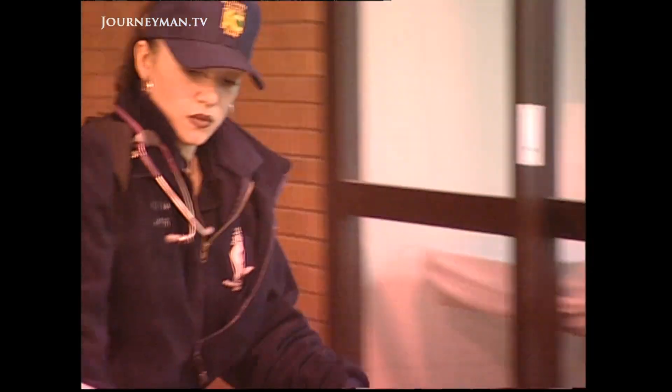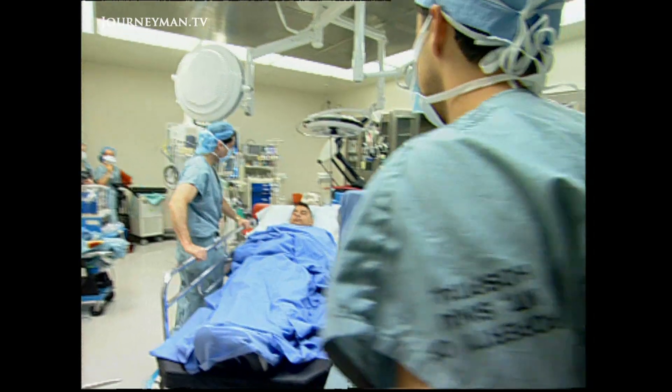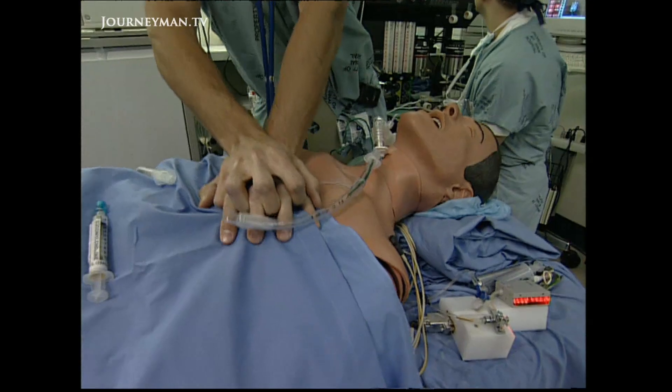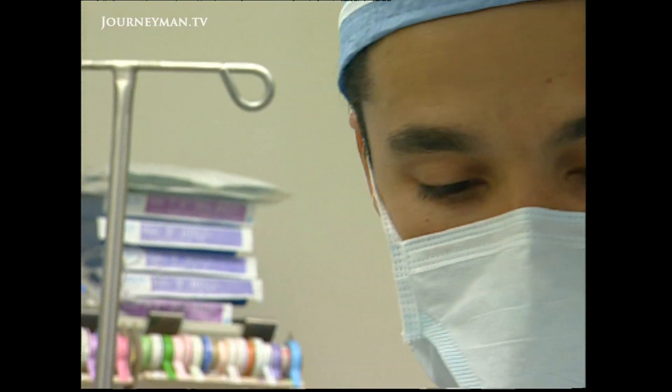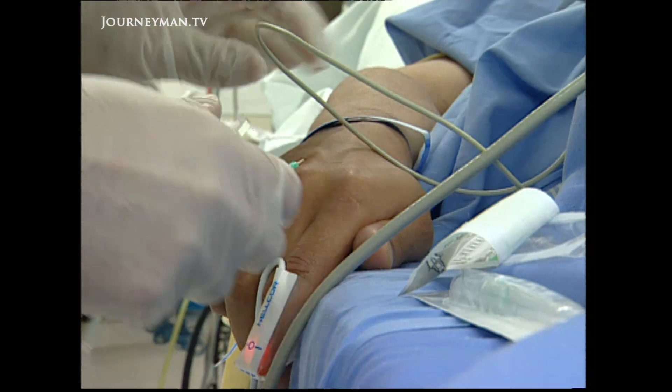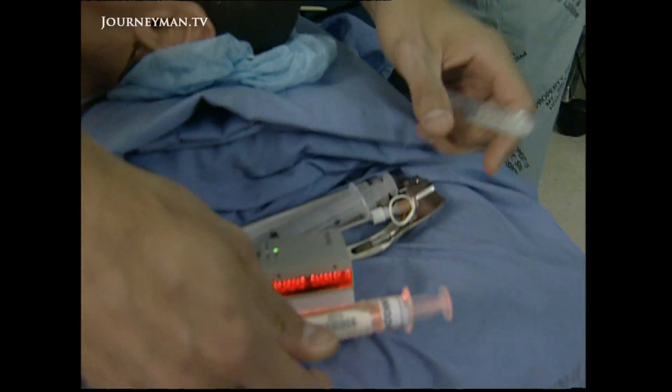Emergency medicine. There's no time to waste and no time to think. A doctor's decision can mean life or death. Whether in the emergency room or just a routine operation that's gone wrong, under pressure, mistakes can be made.